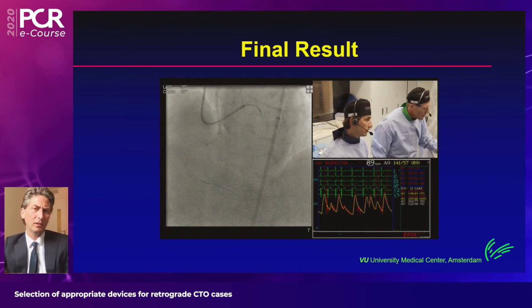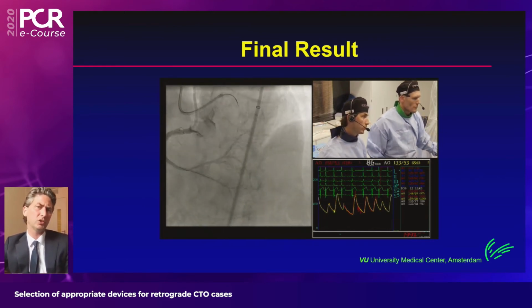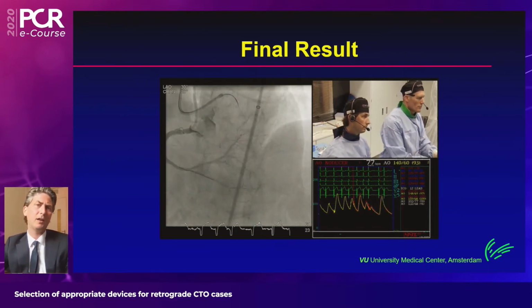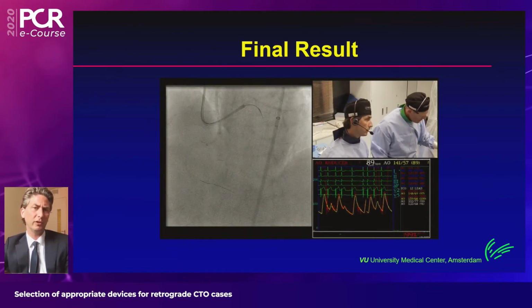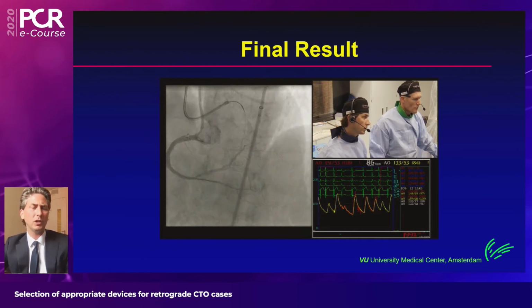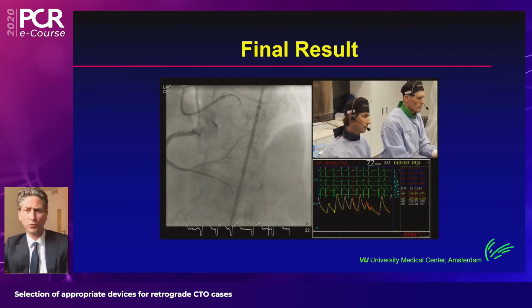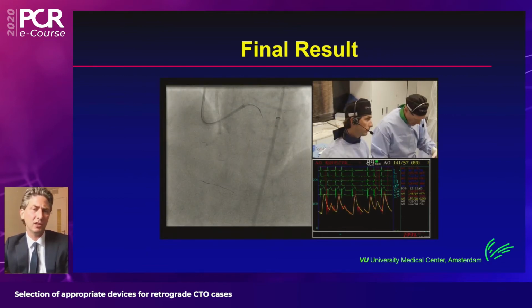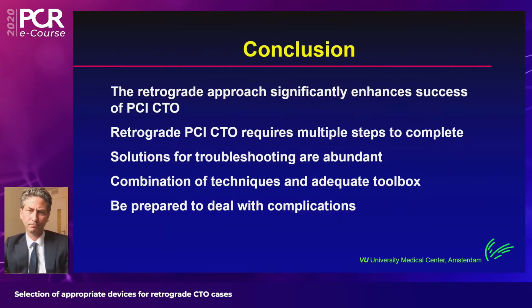And I can tell you that this case was done in 2017, and in 2020, I just recently saw the patient. He's doing fine and well, and had another procedure on the circumflex, and the stent patency of this right coronary artery was still excellent. Even though it's a dissection reentry technique, we know that if you don't have residual stenosis and you have TIMI 3 flow with preservation of all branches, then the results are as good as intimal stenting in the long-term outcome.